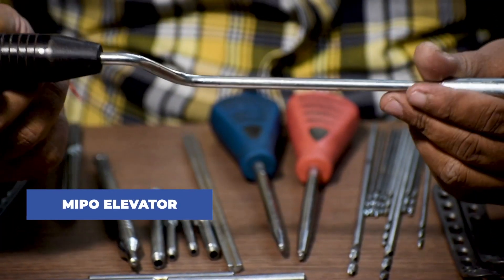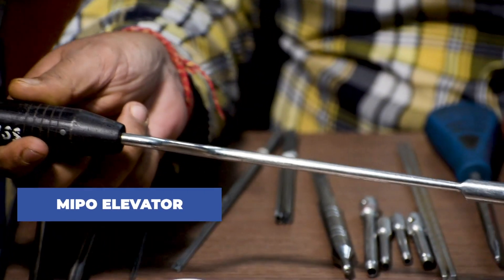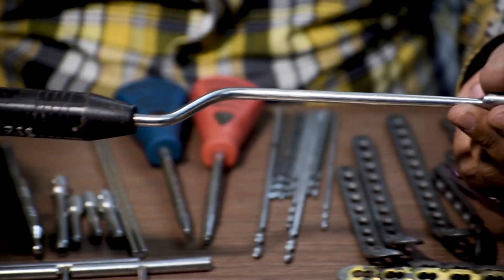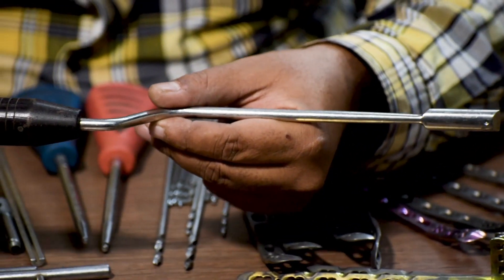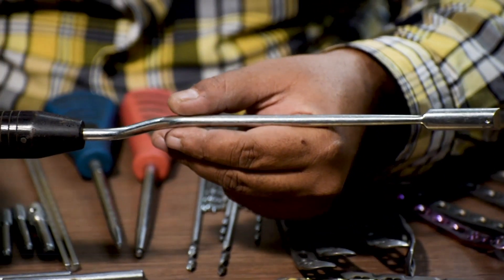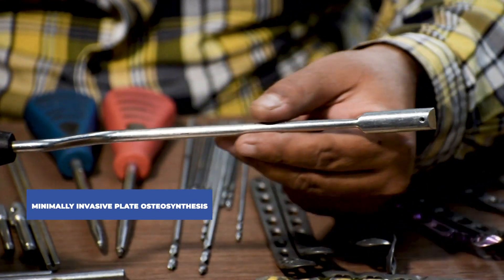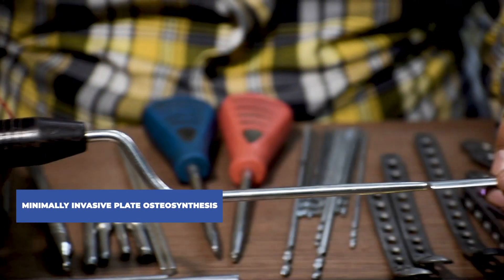The tunneller is inserted in the fracture site for tunneling. That procedure is called MIPO — MIPO stands for Minimally Invasive Plate Osteosynthesis.